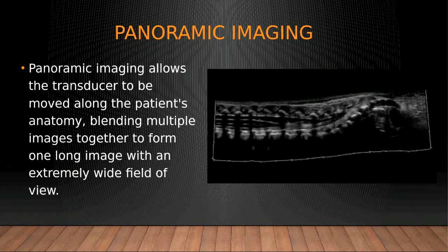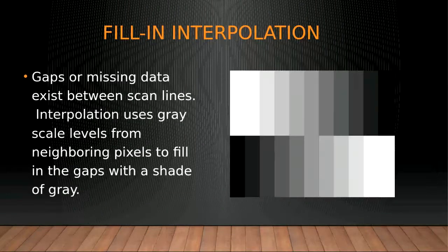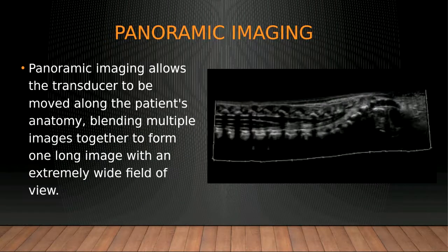So all of these controls you can adjust or choose to use, with the exception of the fill-in interpolation. That's going to be done automatically. So again, in this section, know the definitions, know what makes them different. I tried to highlight those things when they start to blend together, and then be prepared to do a matching section on enhancement tools as well.